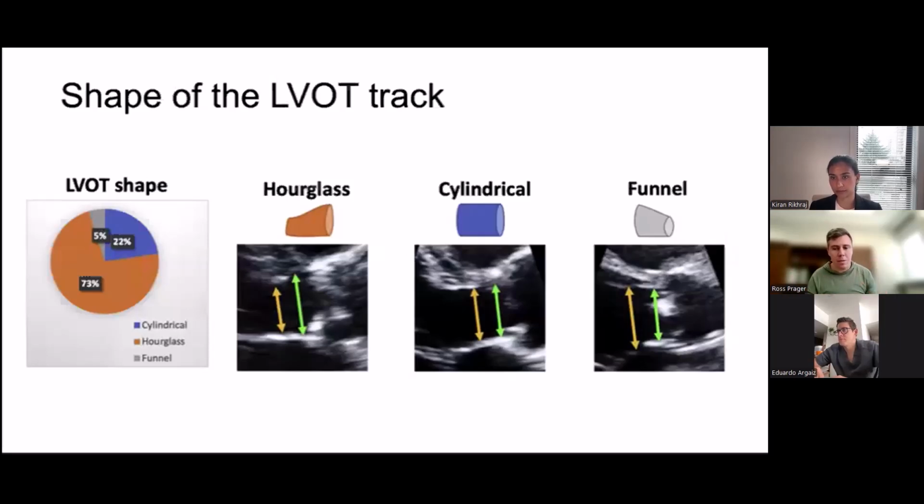And there might be an echocardiographer listening to this who's going to lose their mind about this, but this is an actively discussed, debated and researched area of the field. But you can see, even just based on the variability in shape here, measuring it in general has so many potential limitations that it just isn't really worth it to me. Because you can either overestimate, underestimate, or just frankly measure the wrong LVOT diameter based on the shape of the LVOT, which is not cylindrical in most patients.